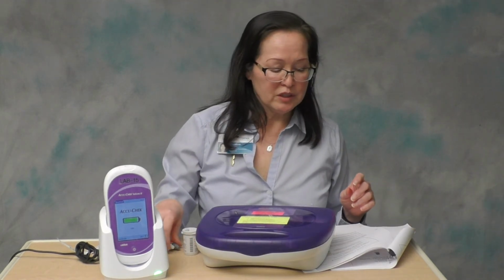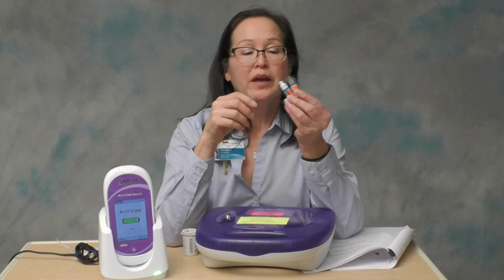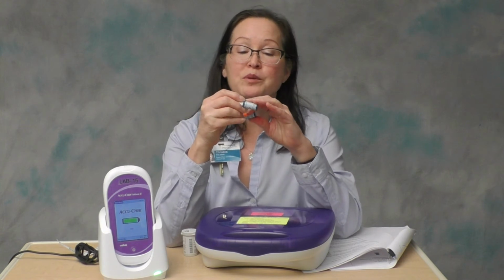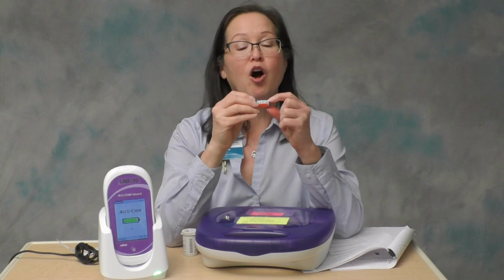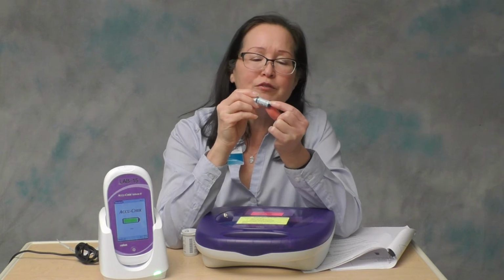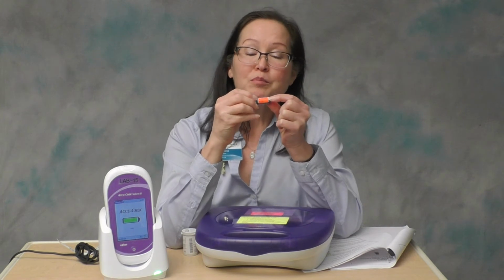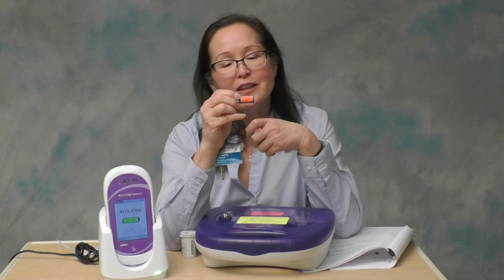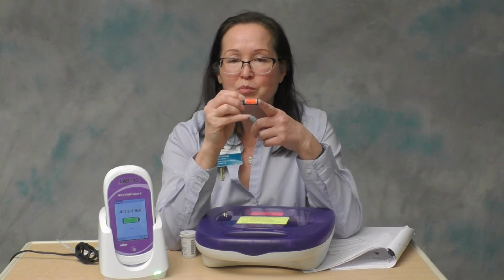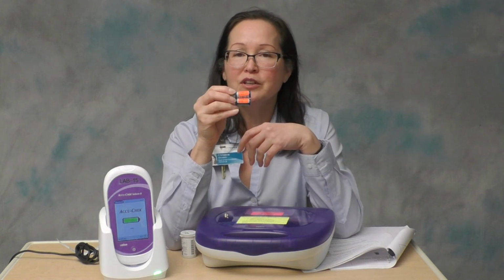The QC solutions have an open vial expiration date of 90 days. The manufacturer produces these little tiny bottles with super slick plastic labels that you cannot write on with anything. Plus, they provide a microscopic spot for you to record the expiration date. So, to do everyone a favor, the point of care office labels the vials with the 90-day open vial expiration date with this bright orange label, and we distribute these to all the nursing units every 90 days.